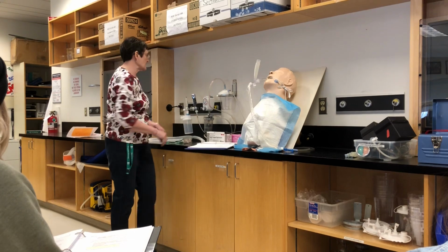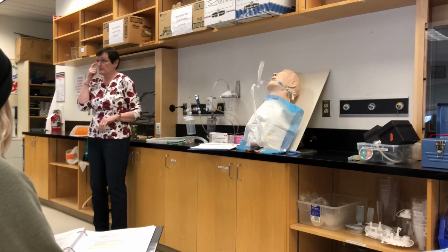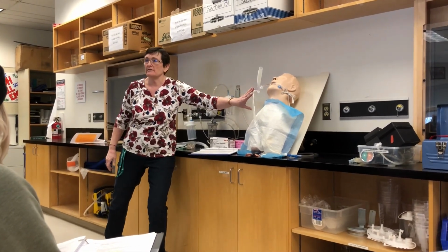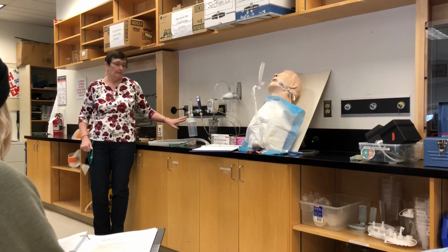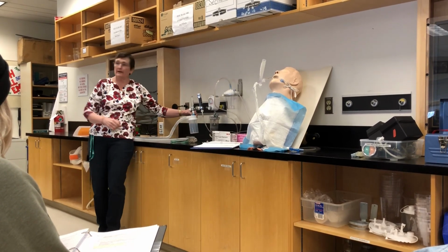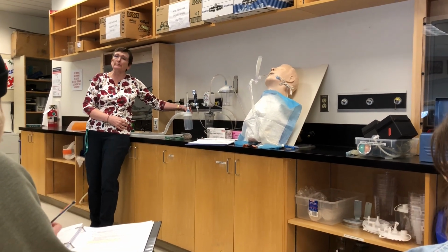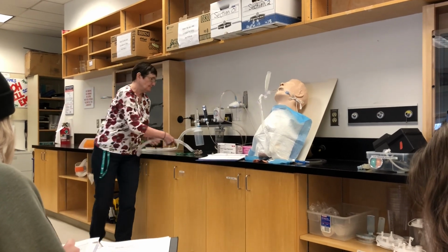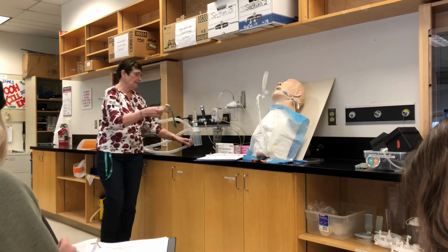Okay. All right. So we've got suction. Suction's on. And we're going to set up oxygen for post-extubation. Okay? So right now he's on 35% on the ventilator. Okay? And I'm going to set up a nebulizer. It's got water in it. What do I set the FiO2 at? 45%, right on. So 10% above what they're already on. Okay? Got my mask ready.